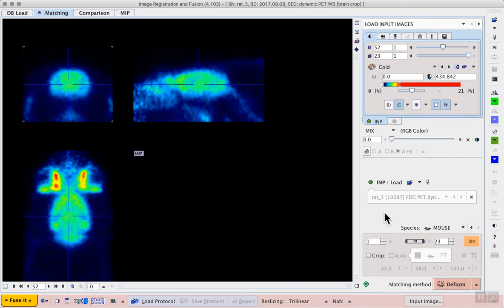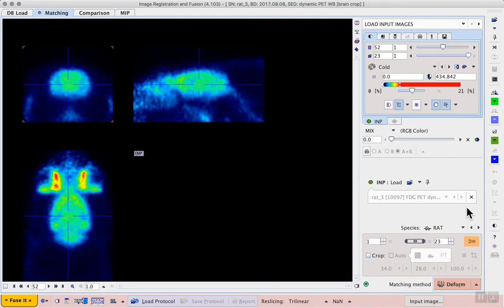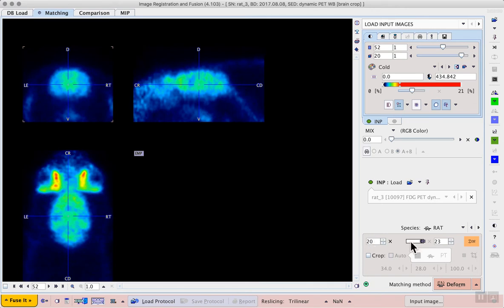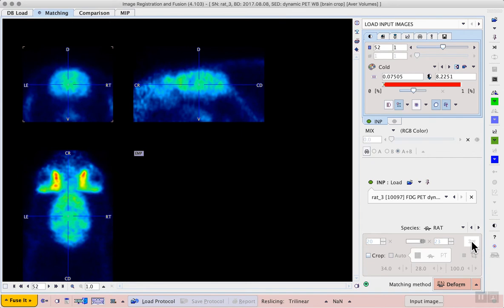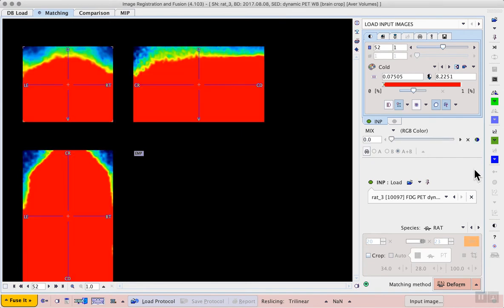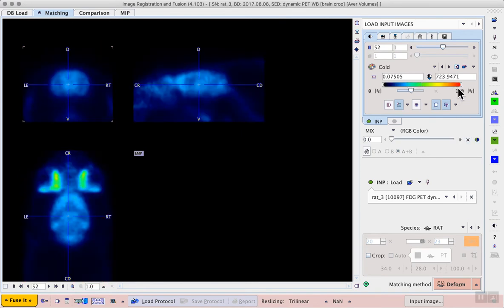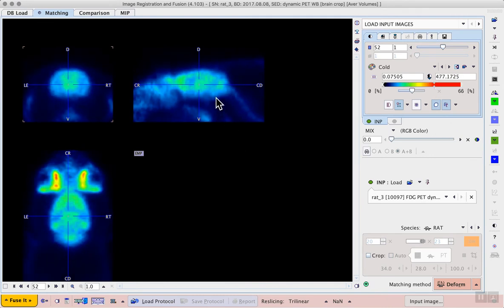An even better average for matching to the template can be created by averaging some later frames. In this case, an average of frames 20 to 23 works well. So in the lower right workflow, we can set the species to rat. The mouse is detected because of the small volume of this cropped image. Then we can enter the range 20 to 23 and calculate the average. We now have an even more clear image of the late FDG uptake. This average will be used to match to the template and then the transformation that we calculate can be applied to the dynamic series.